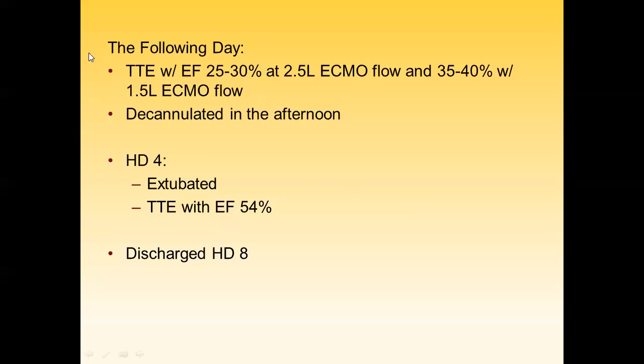Question about, one about decannulation. Can you decannulate just by moving the cannula, or does it have to be cut down with suture? And the second question is, since you're reversing the physiology of the circulation, are the SWAN numbers still valid in this patient? Good question.